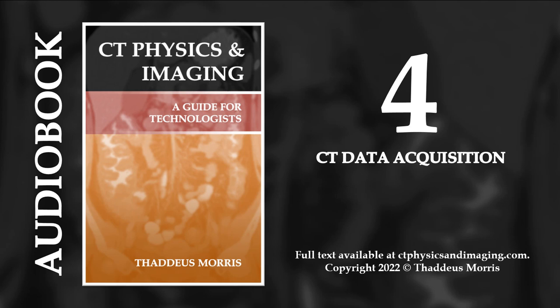Not all scanned data collected during the imaging procedure is actually processed for viewing. Only the data within the display field of view, set by the technologist, is processed and displayed as the image data. The entire data set from the scan field of view is saved on the CT computer as raw data, but it is not processed and it cannot be viewed without retrospectively reprocessing the scan. Any area outside of the scan field of view is not scanned and cannot be viewed.